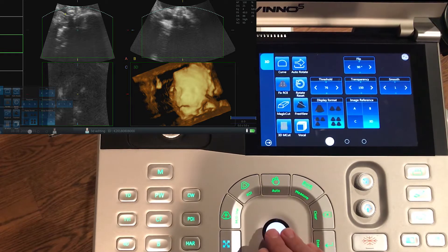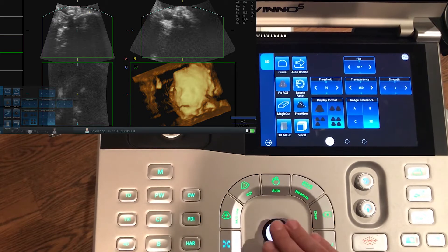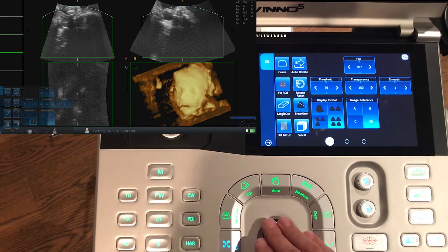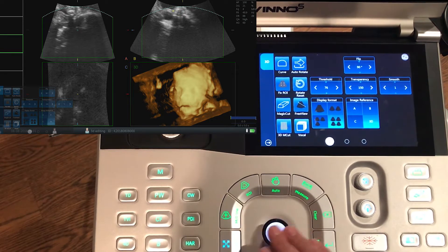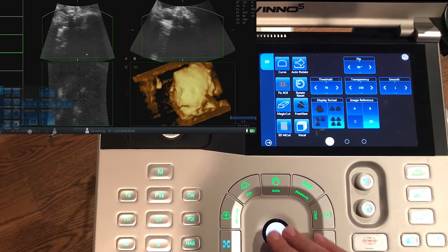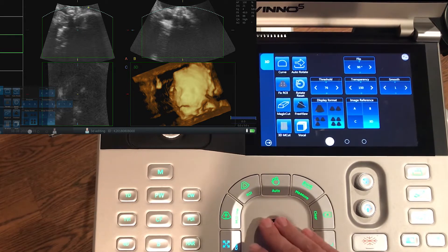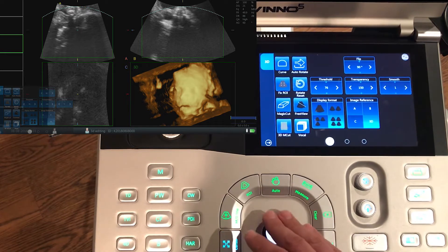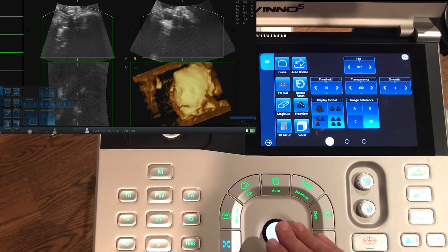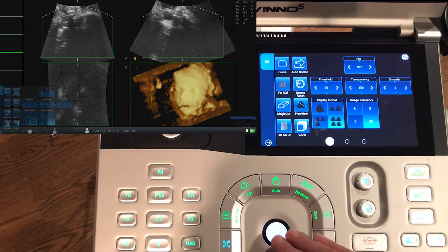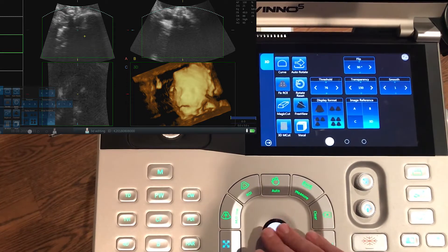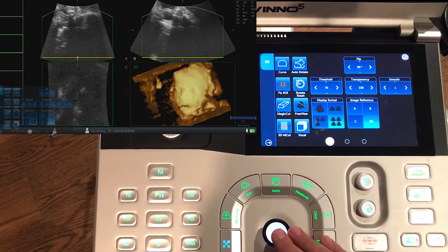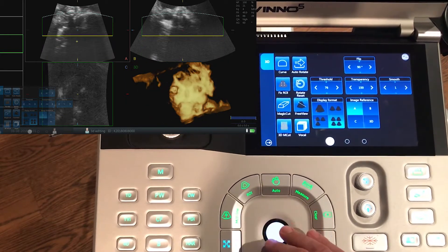We don't really have any fluid between the baby's face and anything around it. On the X axis we can see that maybe we've got a little bit more room, so we'll see if we can manipulate this image. Also, we've got a lot of space down here and hardly any space to move up the top. It might have been better if the ROI box was positioned a little higher to give us more room to move, and not so low — there's no echoes down there, just shadow, so it's not usable.